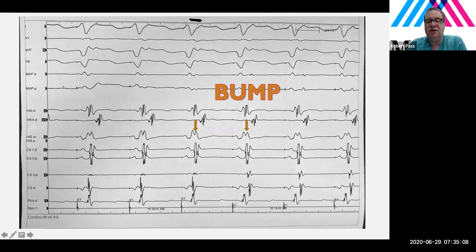This happens to all electrophysiologists. If this hasn't happened to you, you haven't done enough ablations. But one of the lovely things about 3D electroanatomical mapping is that we can identify exactly when the signal changed from this to this. Because notice now the VA pathway is earliest in the proximal coronary sinus versus the latest, right? You see this pattern. Look how long the VA interval is here now versus here where it's the earliest. Now this A is earlier than this A is earlier than that A, and so on and so forth.